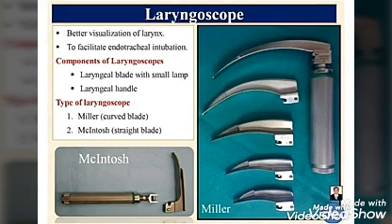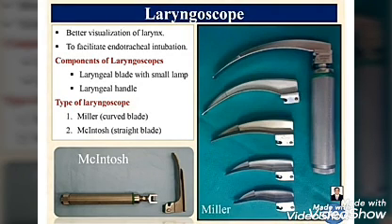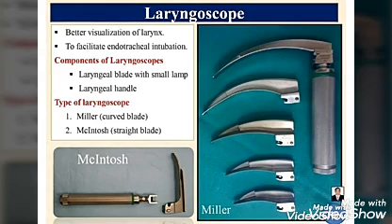Even a mobile light is also useful for the administration of the endotracheal tube. Proper visualization of the laryngeal region is our aim. In the market the tongue depressor costs hardly 30 rupees. The tongue depressor is helpful for suppressing the epiglottis.